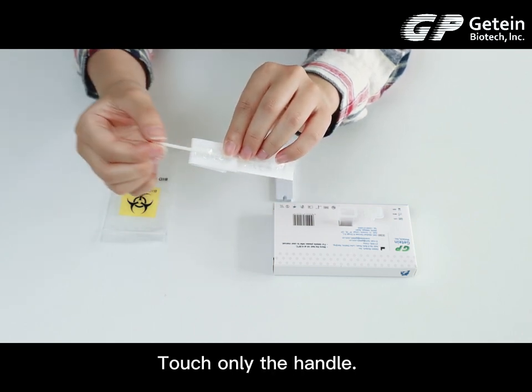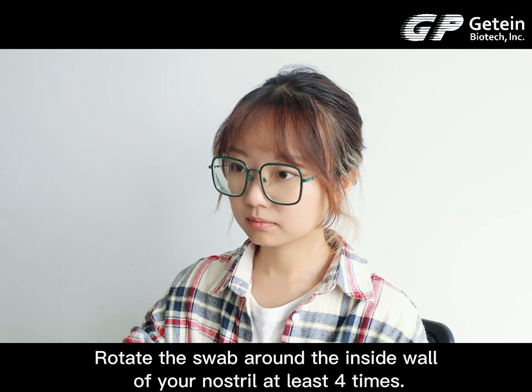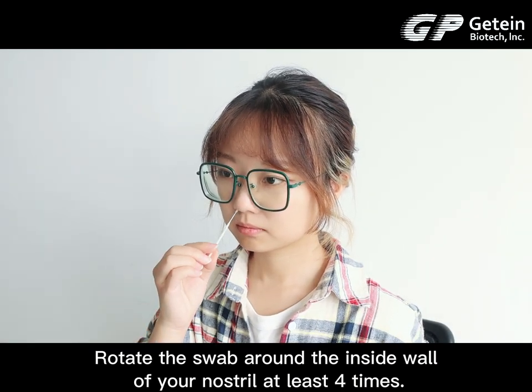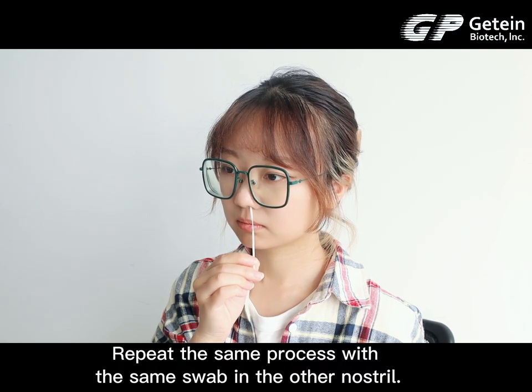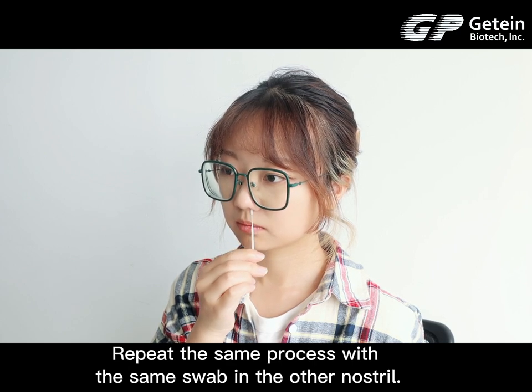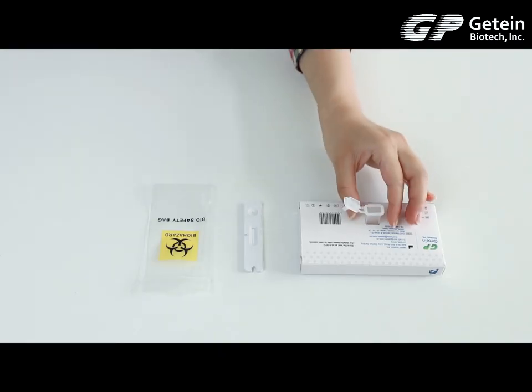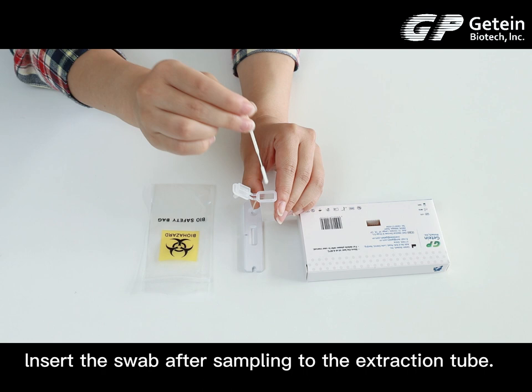Touch only the handle. Rotate the swab around the inside wall of your nostril at least 4 times. Repeat the same process with the same swab in the other nostril. Insert the swab after sampling into the extraction tube.